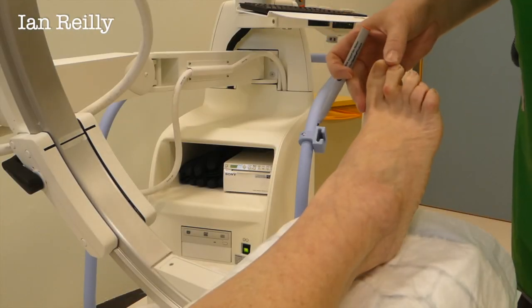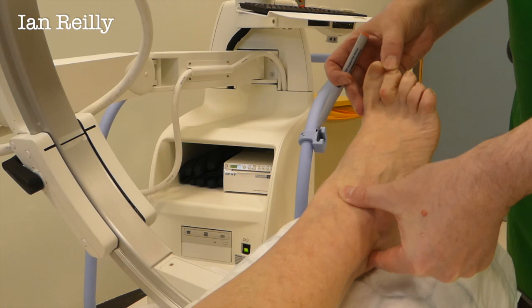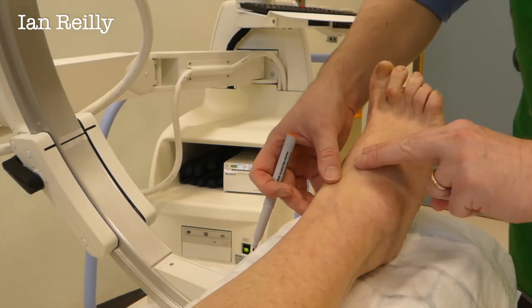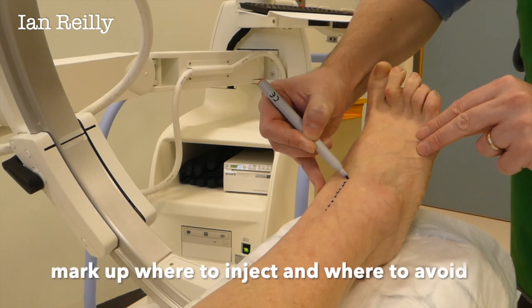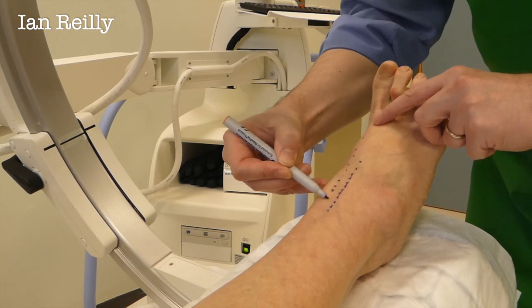I'm kind of talking to the camera a bit really. So your pain is at the front of the ankle here, and the side as well — inside here. I'm just going to mark up some anatomy. So we're going to have vessel and nerve to avoid there. We've got the tendon of the big toe there.